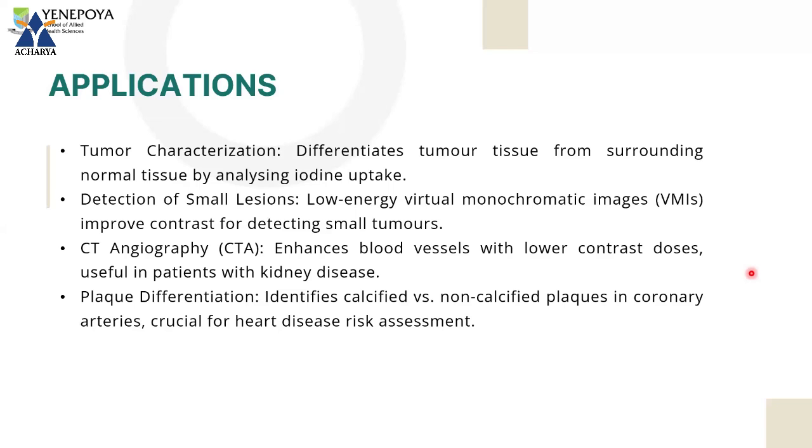Next, when you talk about CT angiography, it will enhance the blood vessels with lower contrast doses. As I told you, if you are using monochromatic images, the contrast in the image will already be high, so it is not necessary to give extra contrast medium.